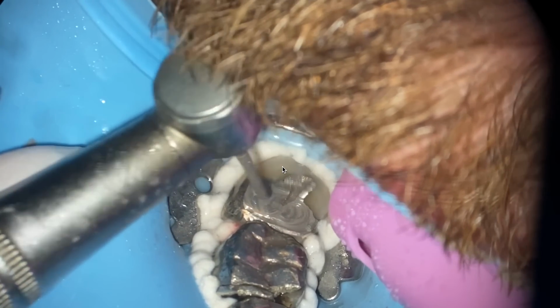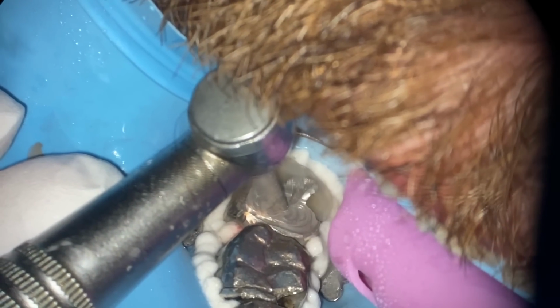I'm going to take this out of occlusion. I'm only reducing it by 1 millimeter. So the shorter it is, the easier it is most of the time. Taking it out of occlusion not only potentially decreases postoperative sensitivity, but it also makes it a shorter distance to get into the orifice and to the apical portion.